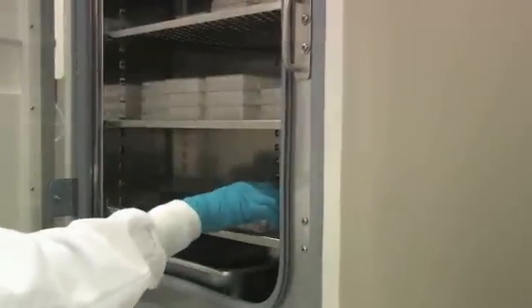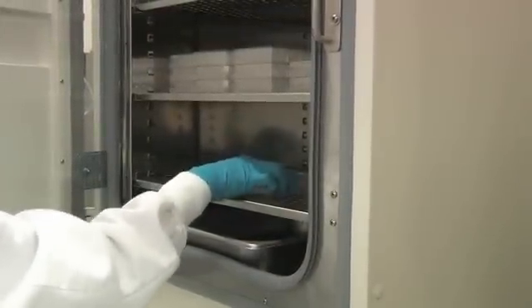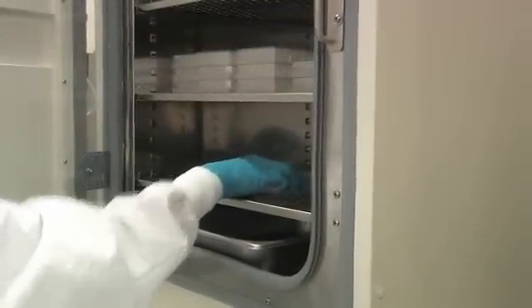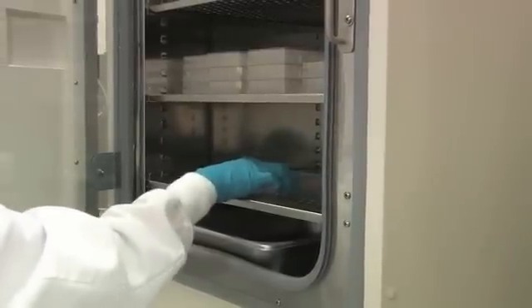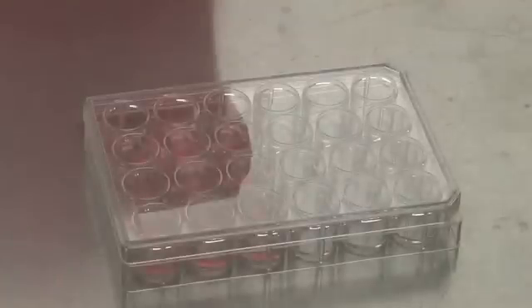Disperse cells evenly across the bottom of the culture wells by moving the plate in north-south and east-west motions repeatedly two to three times. After dispersing, do not disturb the plate for four to six hours to ensure initial cell attachment. After four to six hours, your hepatocytes will have started to attach and are ready for the first feeding into serum-free medium. You can also overlay hepatocytes at this feeding.